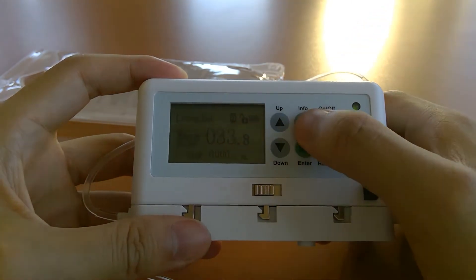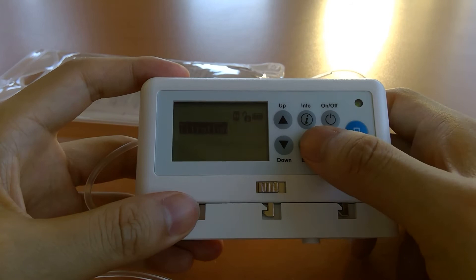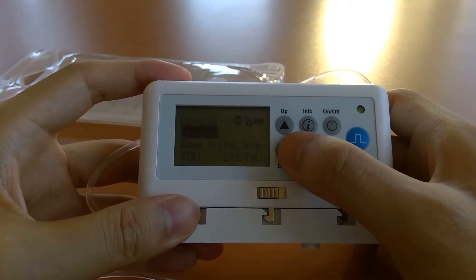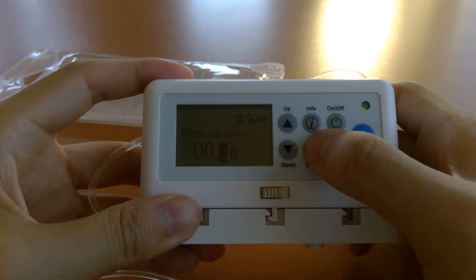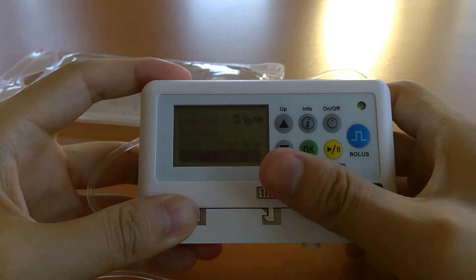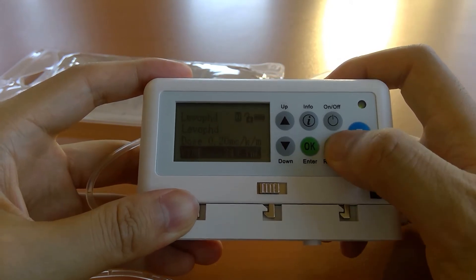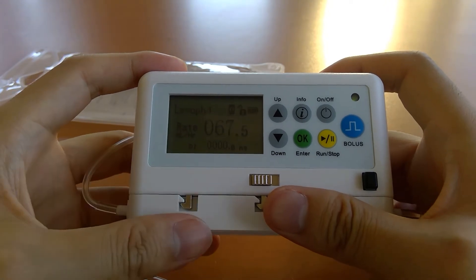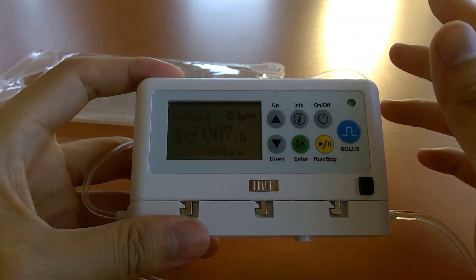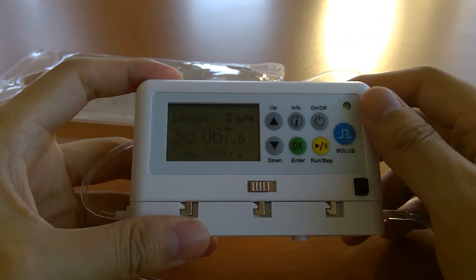To titrate, press the info button and go to the titration option. If you want to change the dose — say double it to 0.2 — press OK all the way through, then press the yellow run/stop key to lock in the change. You can see that the titration happens on the fly with no pause in infusion; it just recalculates the rate right there.